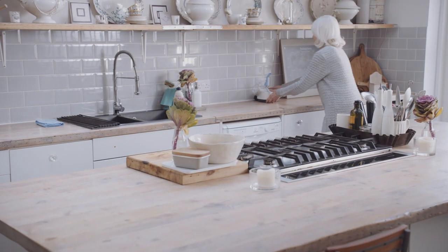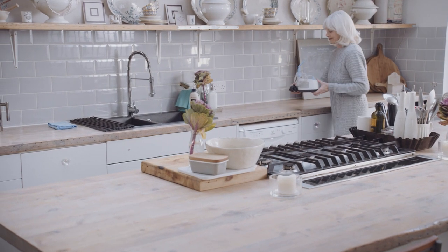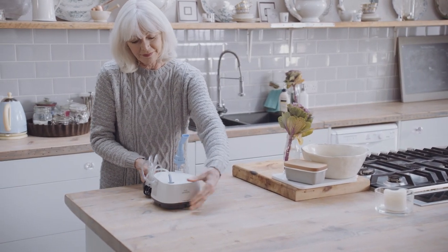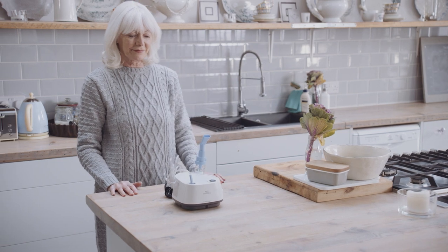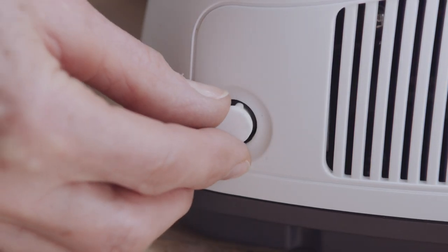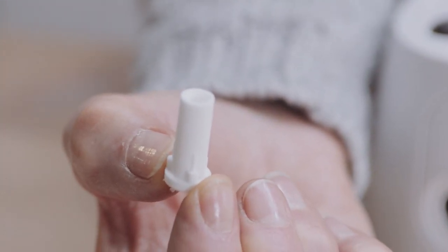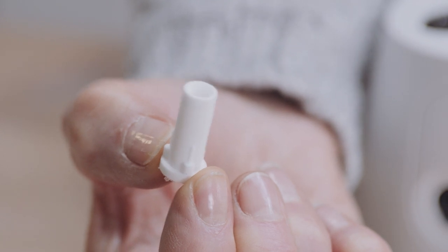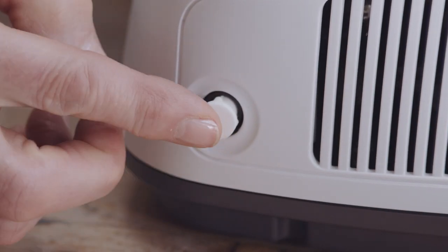Place your Philips Inaspire Elegance Nebuliser Compressor on a firm, flat surface near an electrical outlet, in an area where you can be seated comfortably during your treatment. Check that the filter is not clogged, dirty or wet and replace if necessary. Operating the unit with a dirty filter can impair proper operation and cause damage that's not covered by the warranty.